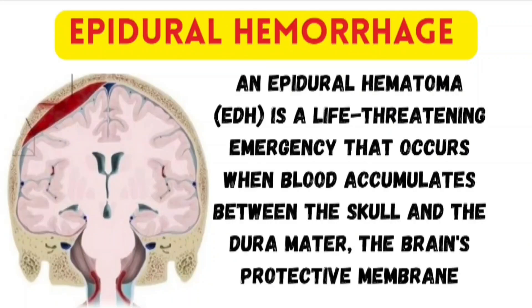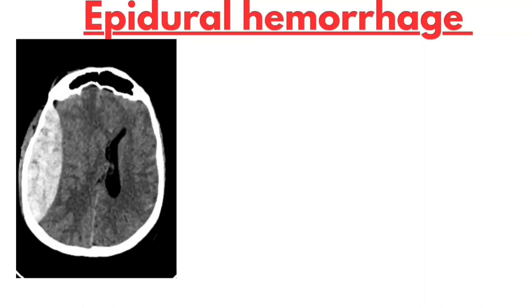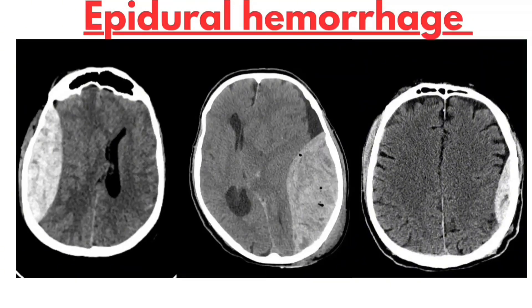Epidural hemorrhage is a life-threatening emergency where blood collects between the skull and dura mater. It usually happens due to head trauma — often from an accident or fall — which causes rupture of an artery, commonly the middle meningeal artery. On CT scan images, notice the lens-shaped or biconvex hyperdense area representing blood between the skull and dura mater. It appears bright on non-contrast CT. This shape is characteristic of EDH and helps differentiate it from other hemorrhage types. It often causes midline shift due to increased pressure, and early recognition is crucial because timely surgical intervention can be life-saving.